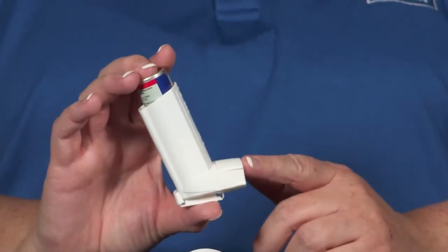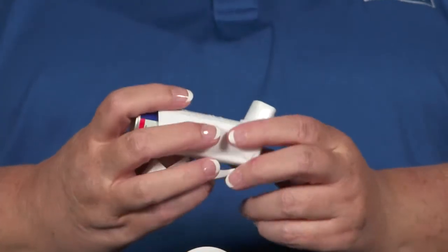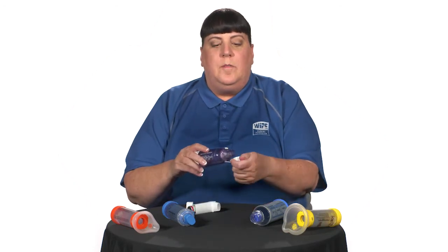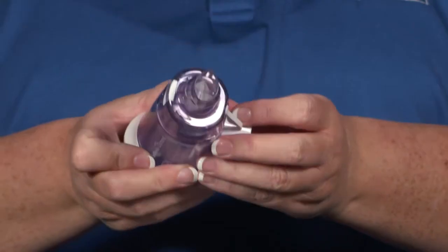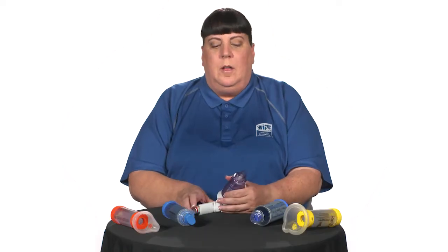When it's time to take your medicine, hold the MDI like this with the cap at the bottom and the metal part with the medicine in it pointing up. Open the cap wide open and look inside to make sure something didn't get in there by accident. Then you're going to take the spacer and open the cap of the spacer and also look inside to make sure there's no stuff in there that shouldn't be there.